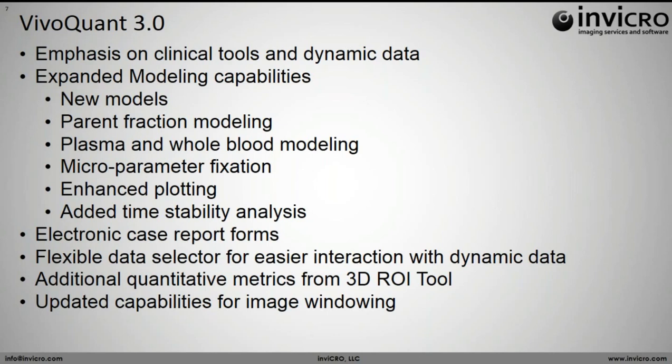And of course, along with all of this, and I really can't emphasize enough that everything that we cover today is also accessible to our VivoScript platform. So that includes our modeling tool, as well as our new ECRF, electronic case report forms, that we've added this release cycle.